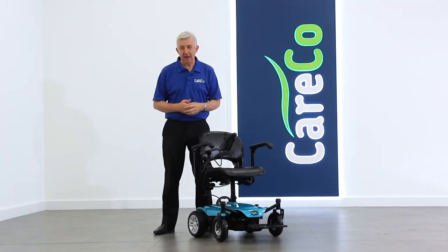Thank you for purchasing the Fenix Powerchair. We've put together this short video to help you with its assembly and also to make sure you get the very most out of your new Careco product.